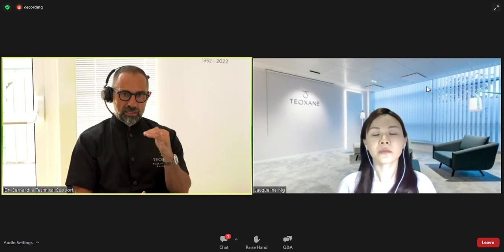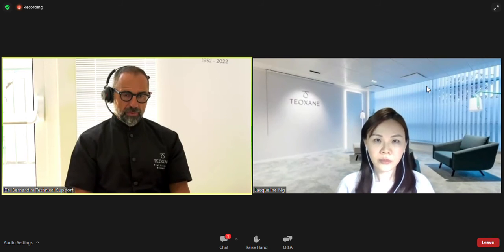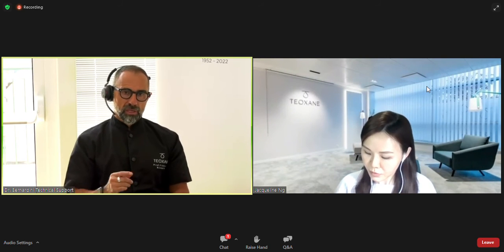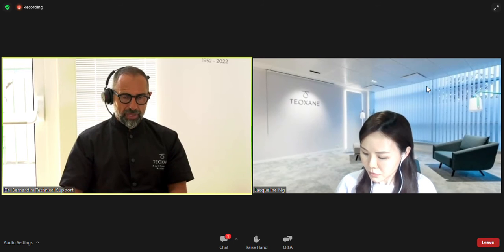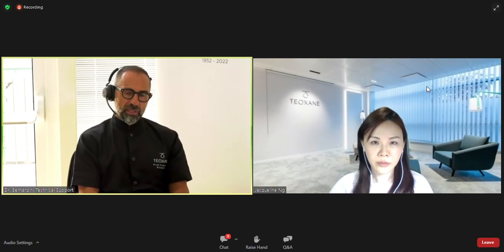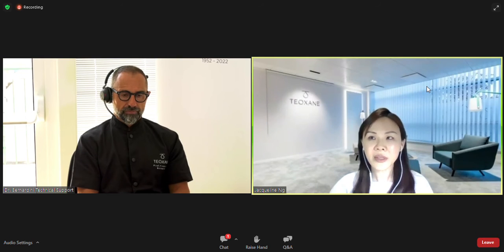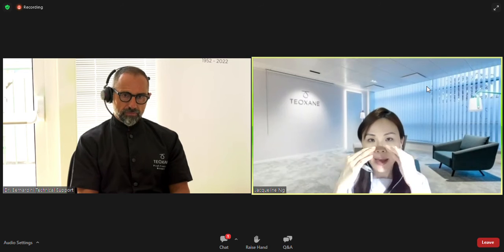I correct it the way that I want. I ask the patient to come back at a month, because I do tend to expect a 10, 12, 20% volume reduction at the month. So the patient comes back at a month and says, very happy, I'm going to stay. Or if they say, I liked it at first when I was a little more full, then I can offer a touch up.